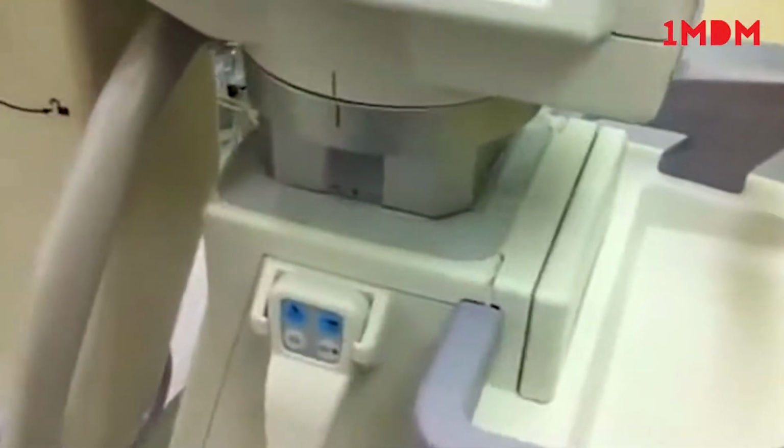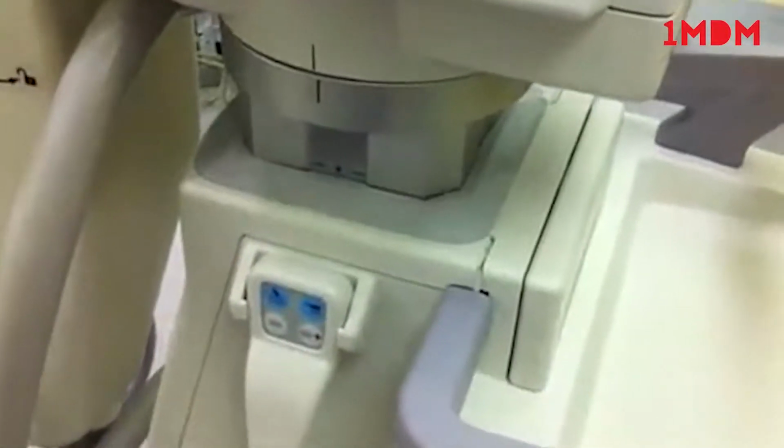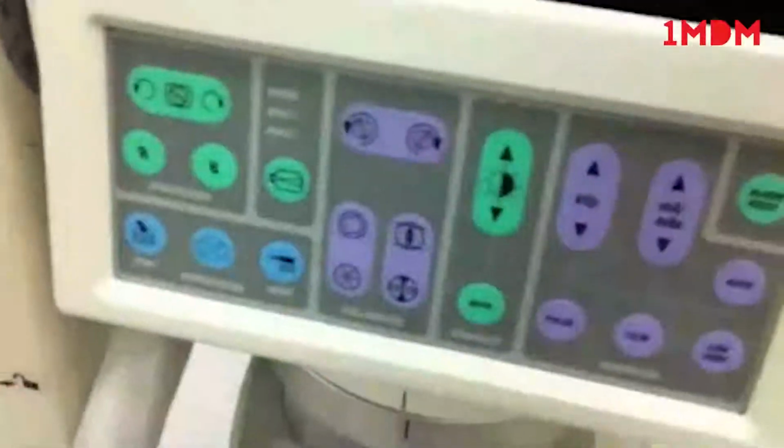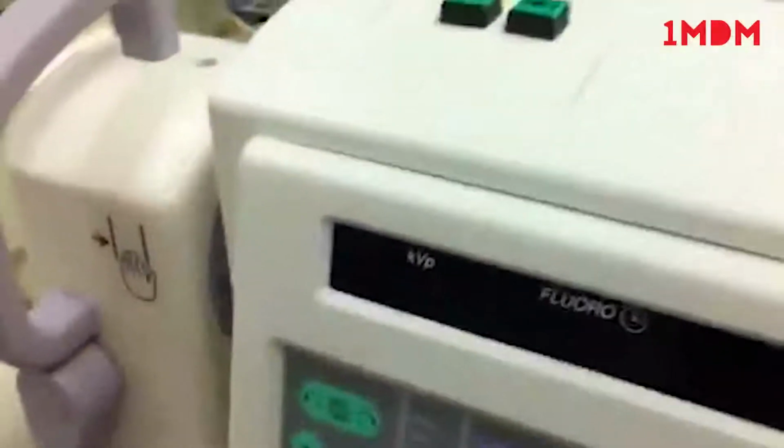Okay, now it's off. So of course when it's off, you want to make sure this is parked back in what I call the neutral position, the storage position. This is all the way back as far as it goes. Everything's at 0, and the C-arm needs to be lowered all the way down to 0. This is so that when we transport it, if this arm was sticking wide out and were to hit something or wobble, it does not warp this arm or damage this column. That's why you want to reset everything to its lowest, retracted position.